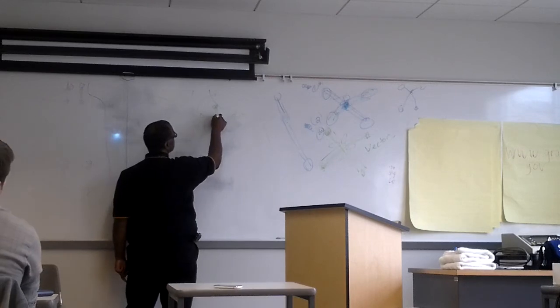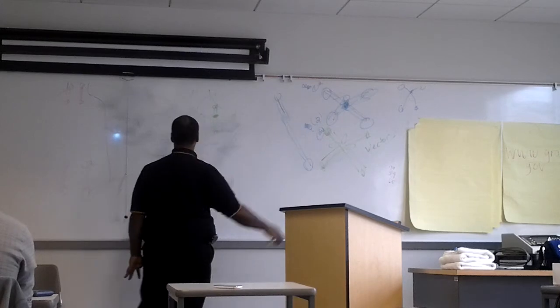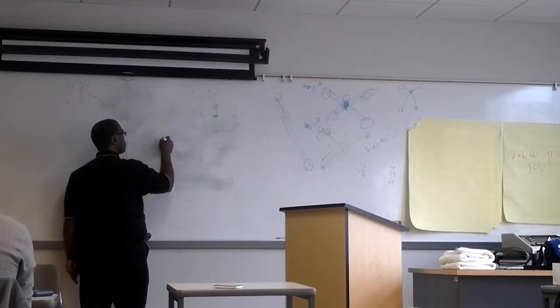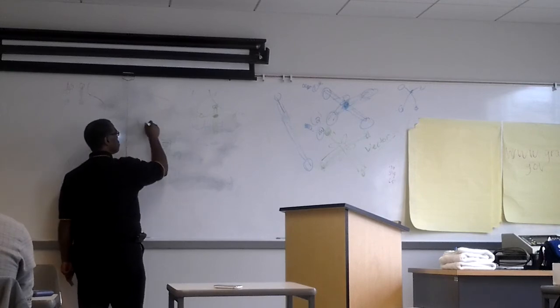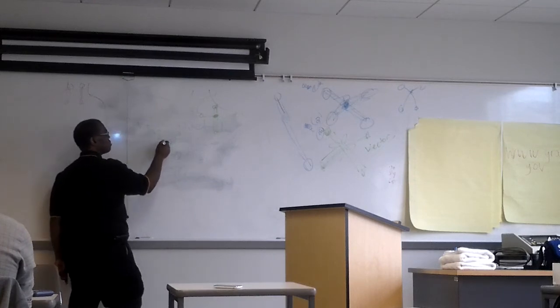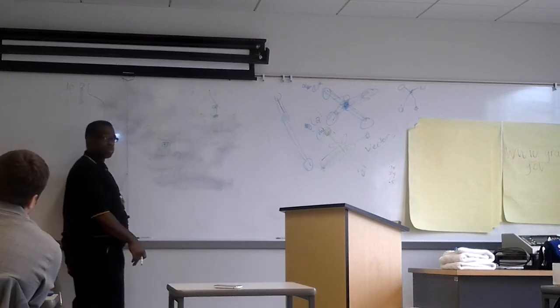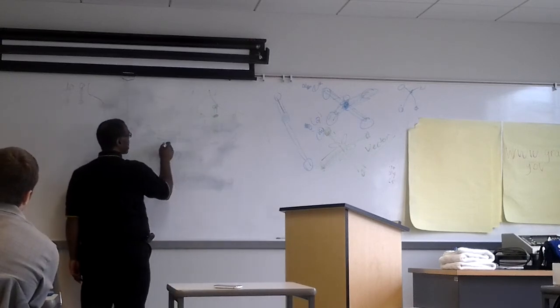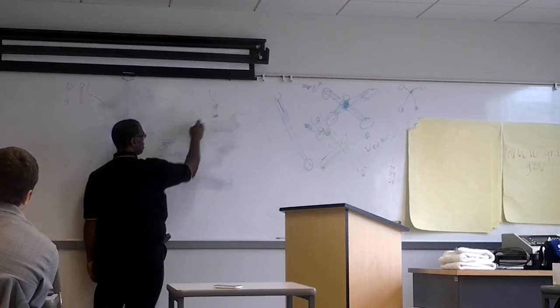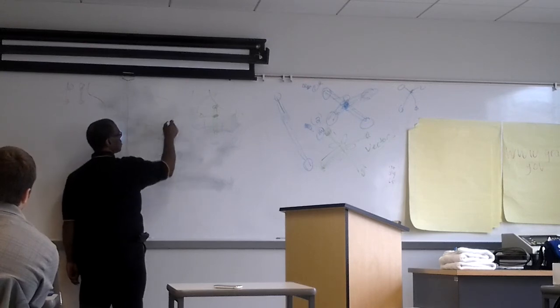So you have this vector that's here. Now on the screen over there it says target. And you'll see basically a vector that will sit in the center. And this center right here represents this center on the person's shoulder. Now, I could cause it to scan an area if I press number 1, 2, 3, 4, 5, 6, I think it goes to 7.